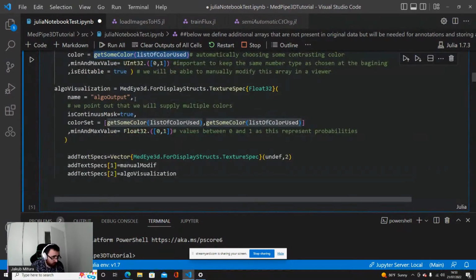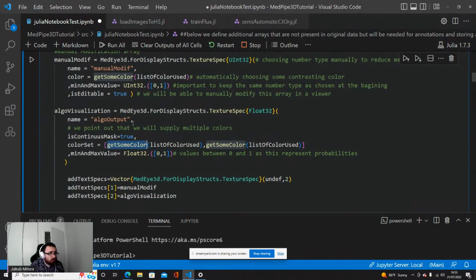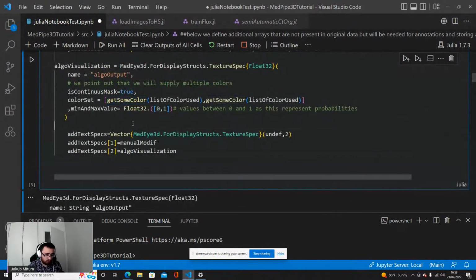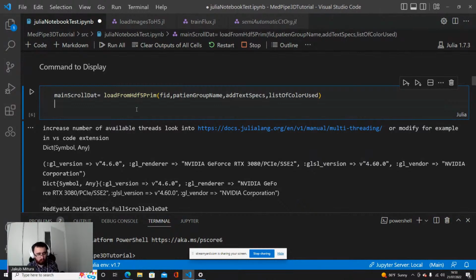However, just one thing to know, when you are using this function, the colors may be different from execution to execution. Yes, so if it's important for you to have exactly the same colors each time you are using it, it's important to override it. I will show you in a moment how to override it.